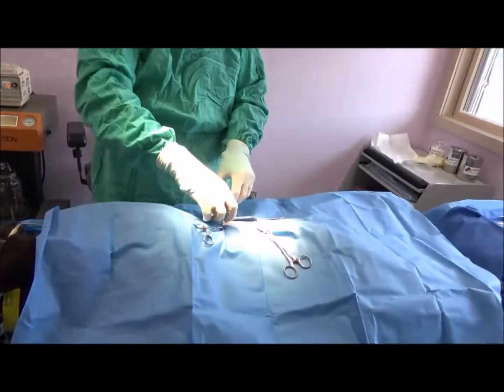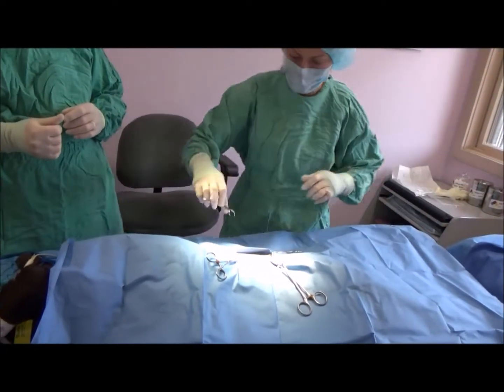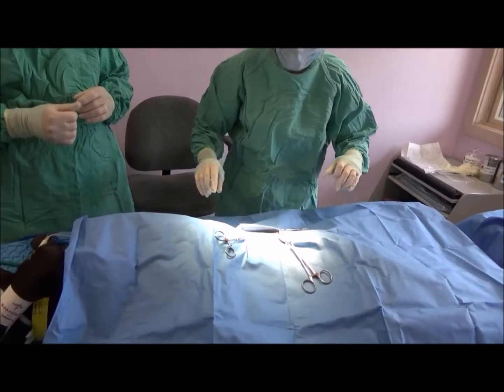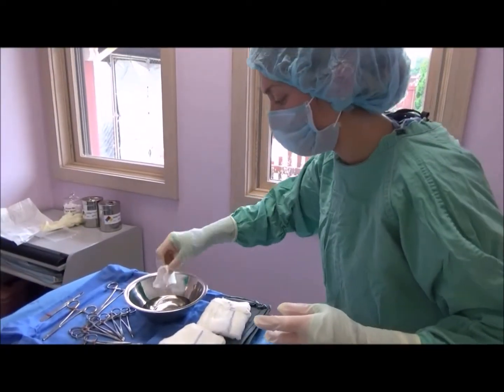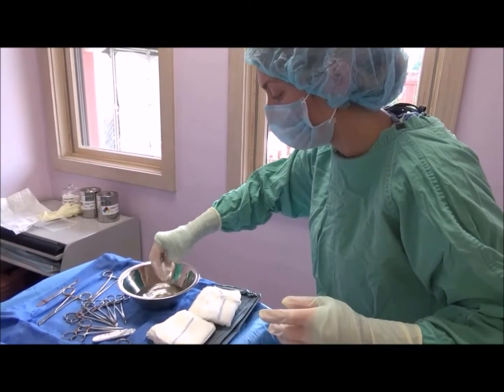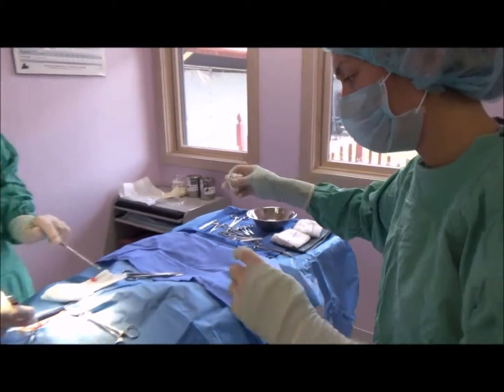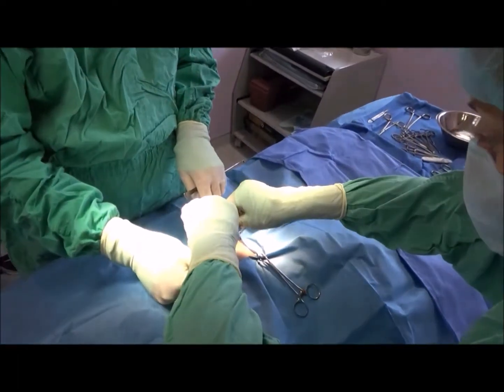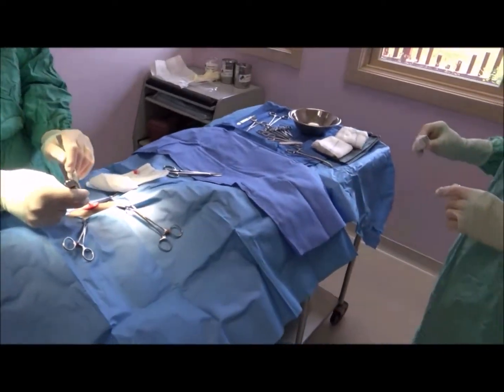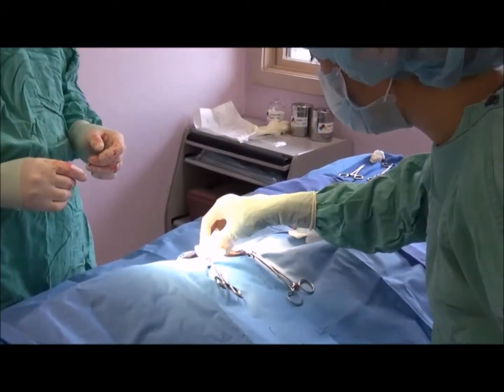Actually, I'm going to come to this side. Okay. So now I'm going to moisten the abdominal cavity here. So I'm soaking it in a sterile saline solution. That's good. So now I'm just going to block some blood.